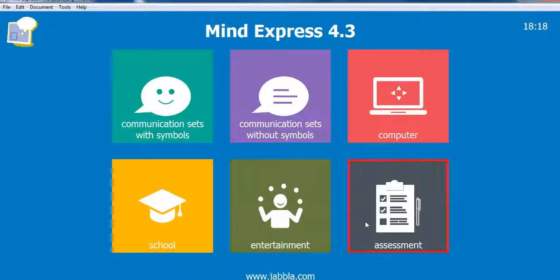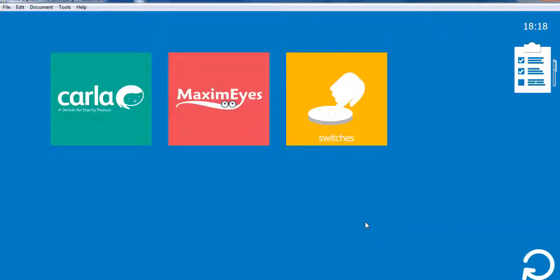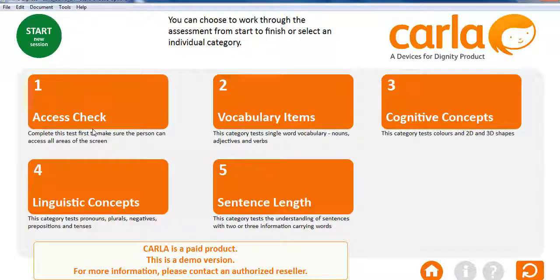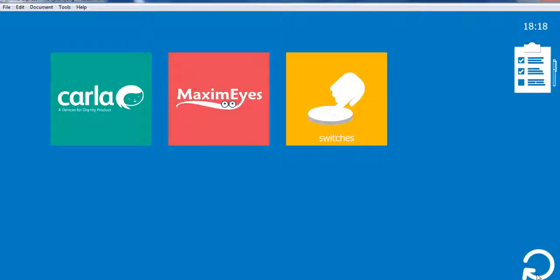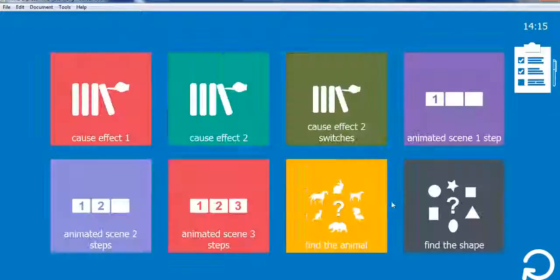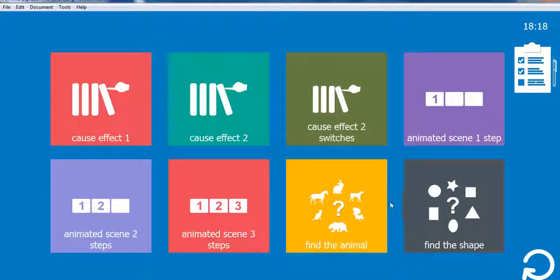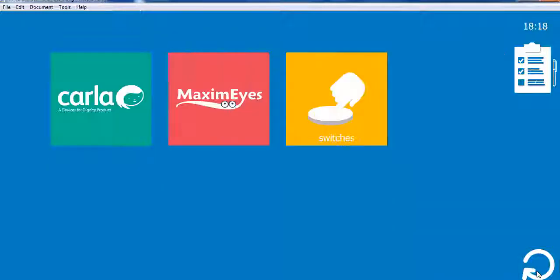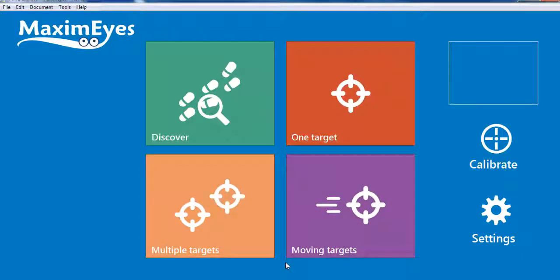There is also a section for therapists, with resources designed for assessment. Here you will also find MaximEyes, a complete training set to develop eye-tracking skills in a fun and engaging way.